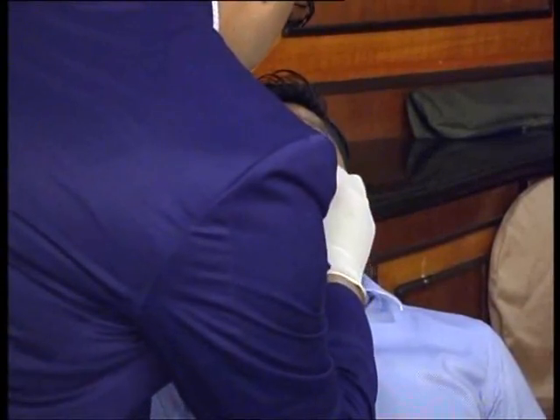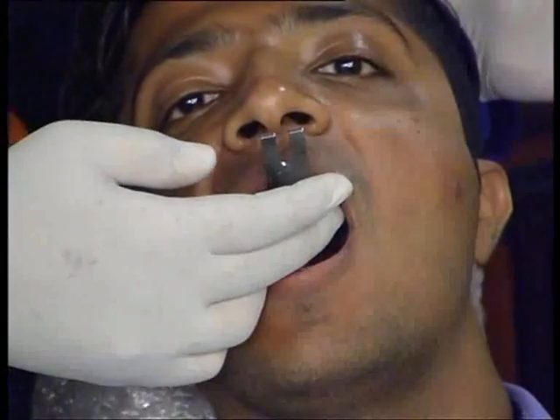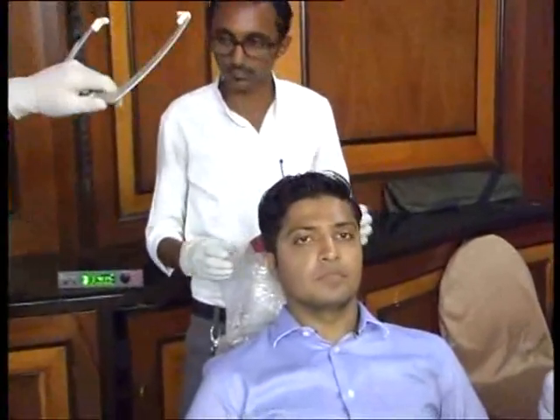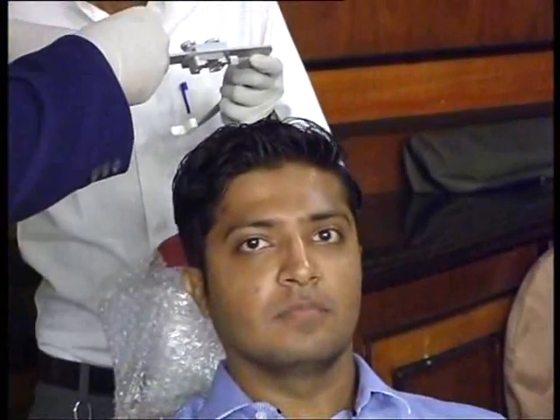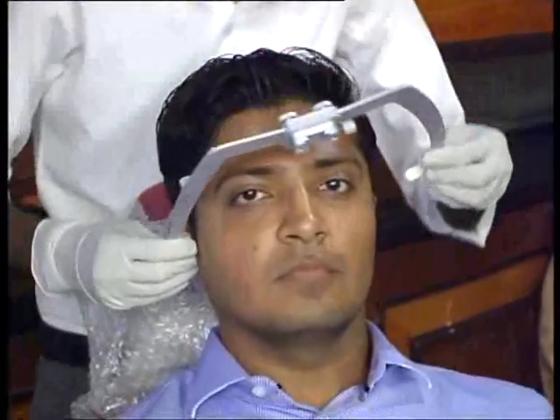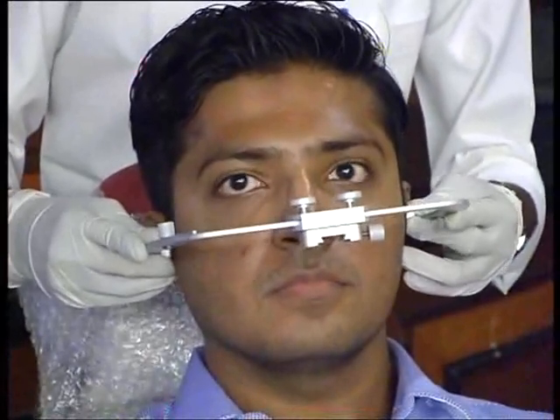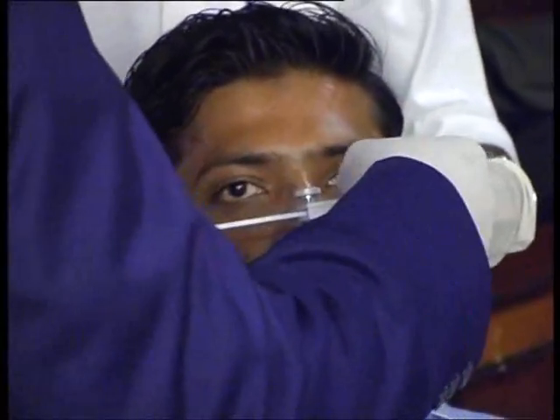This on average takes about a minute, minute and a half to set. Once it is set, you remove it off. Now the U-frame goes in. This is where my assistant puts the U-frame into the patient's ear. This is where you take your patient's help and ask the patient has it gone into both the auditory meatuses correctly or not. As soon as the patient nods yes, there are two thumbscrews here — you will lock these thumbscrews.